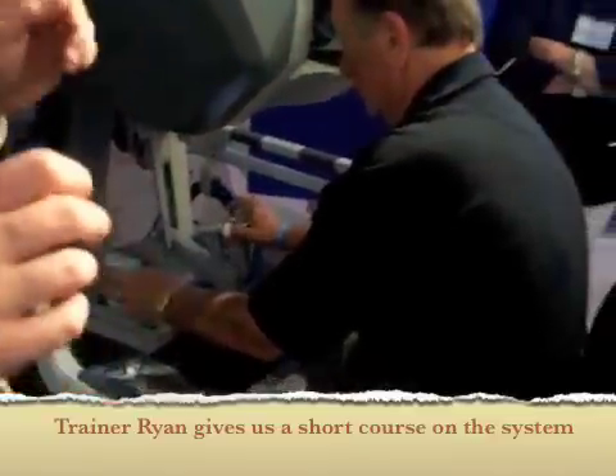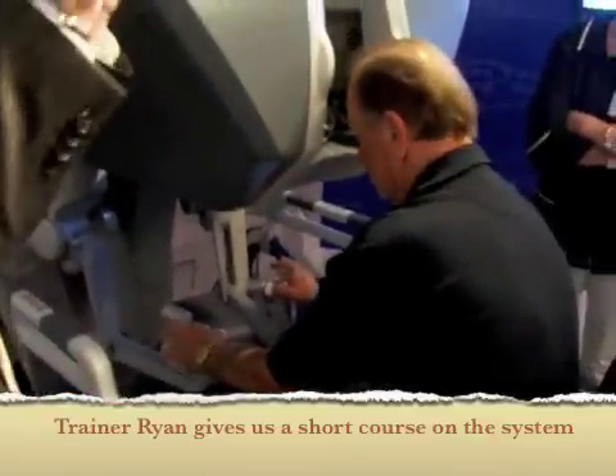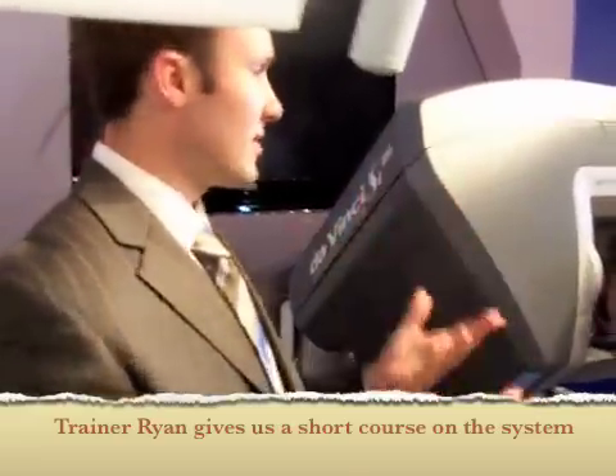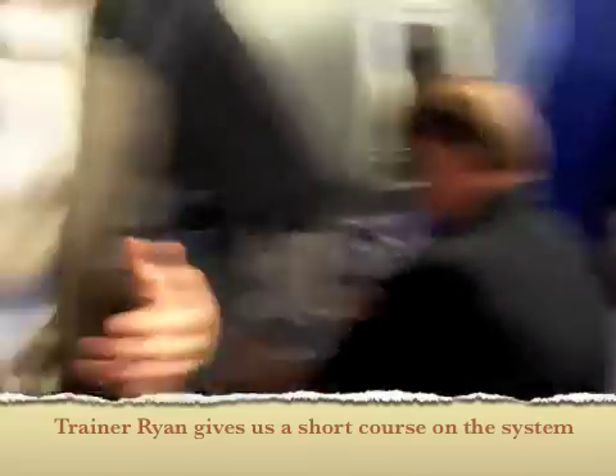To actually tell the system you're ready to work, you have to pinch and release your fingers to engage the instruments. And that's all there is to it. At that point, you can move the instruments wherever you'd like.